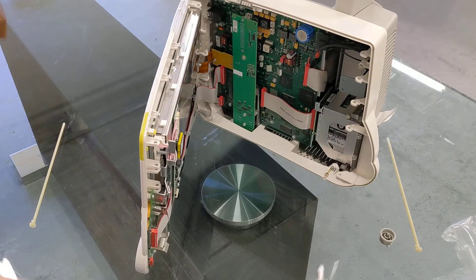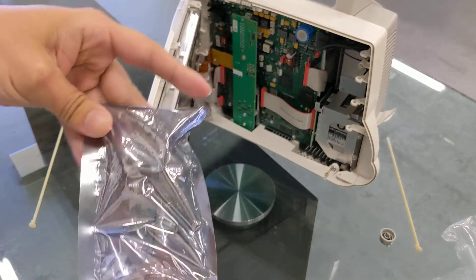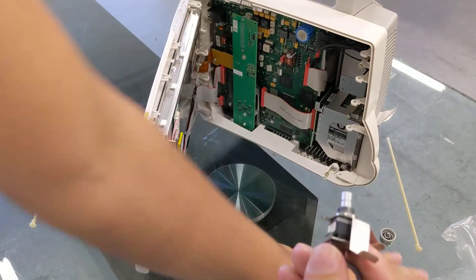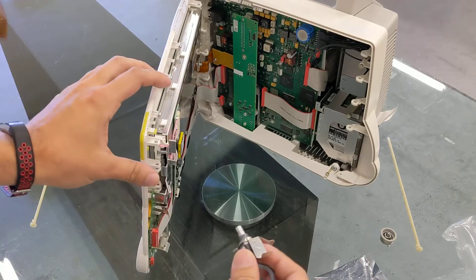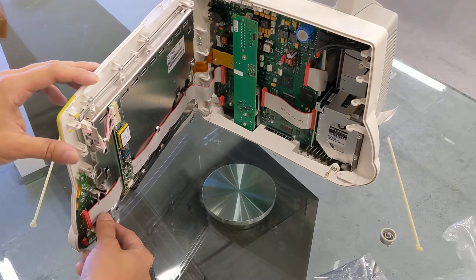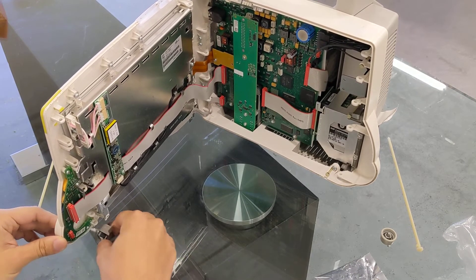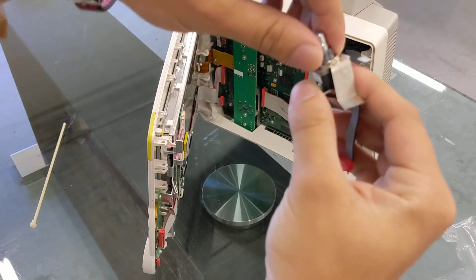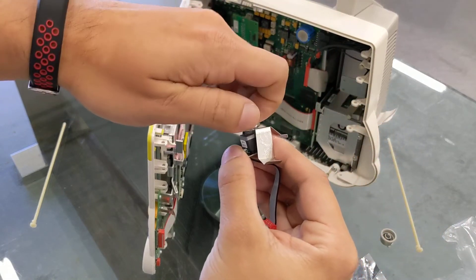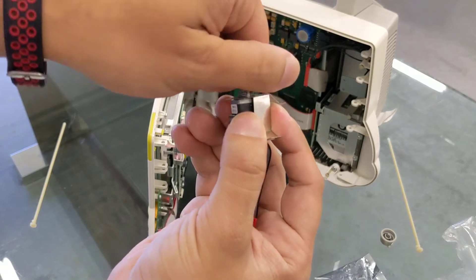Pull out the new piece — we have to make sure it goes in exactly the same way. It looks like it already comes with that mounted metal piece right here. So you have to remove this little ring. This is the part that broke; it just completely came off.